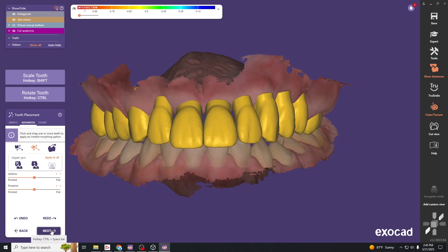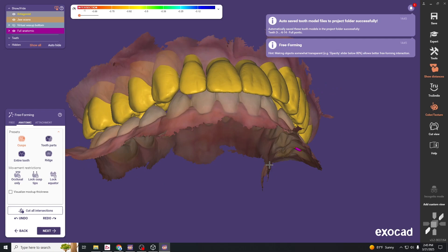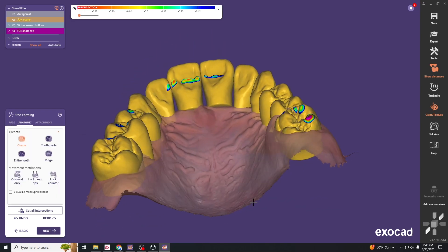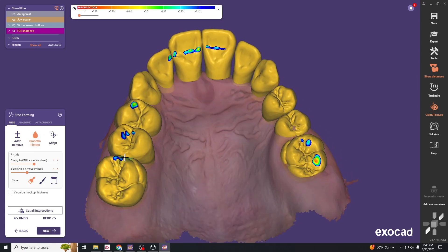Hit next and we're now in the free-forming tab. From here we can make more edits. I like to use add/remove to fine-tune the occlusion — holding shift removes wax material. You can also click on anatomic and then move individual cusp tips, tooth parts, or ridges. The smooth tool is also available here.